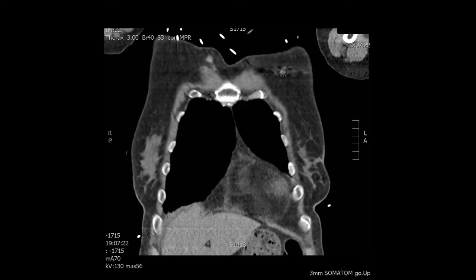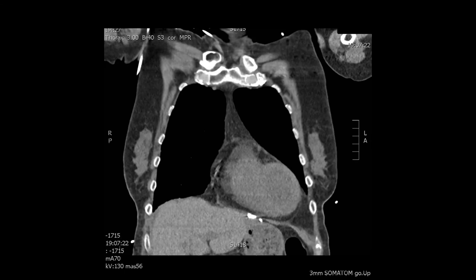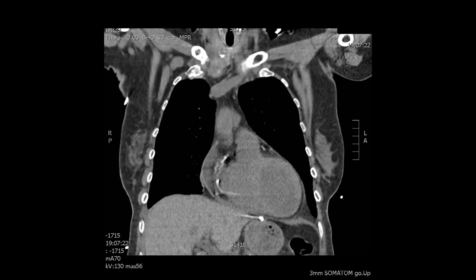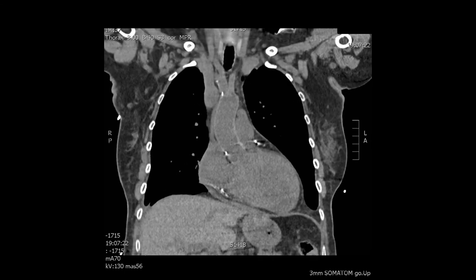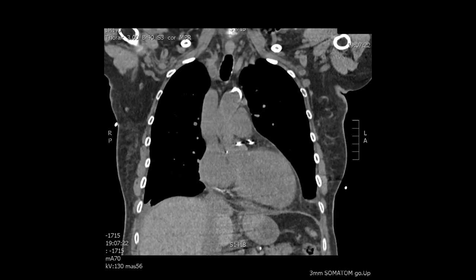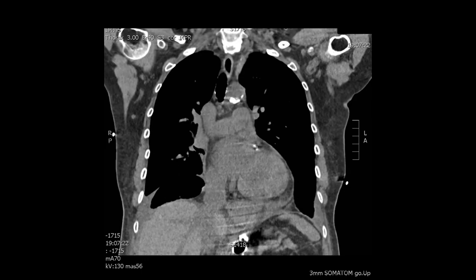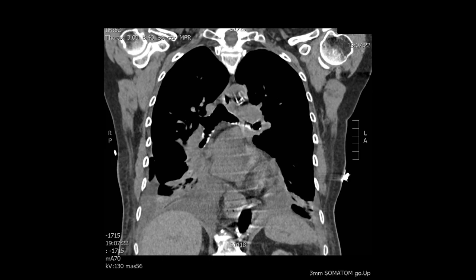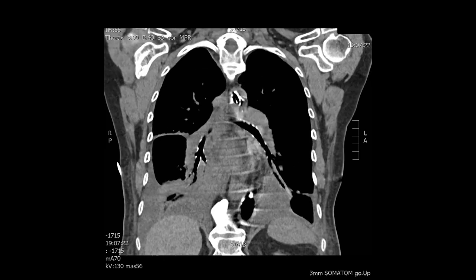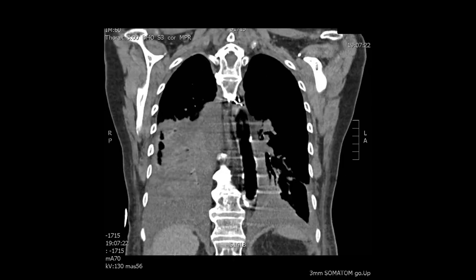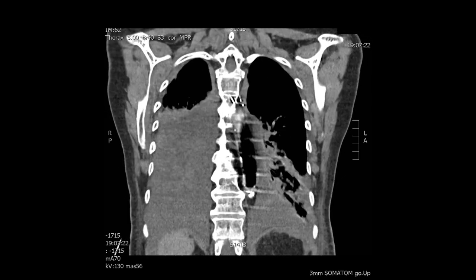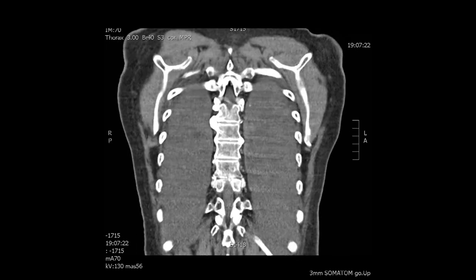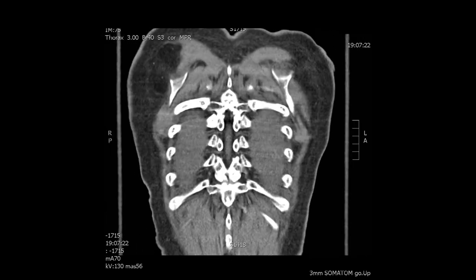In a different plane — front to back — you see the left chest and the right chest, the heart, the aorta, and the arch. Now the descending thoracic aorta is starting to develop, and you see the balloon pump.